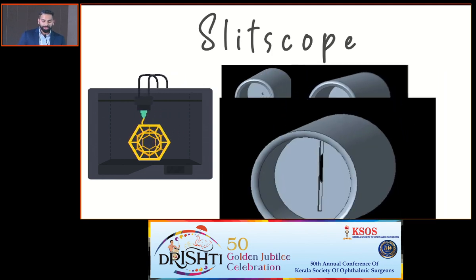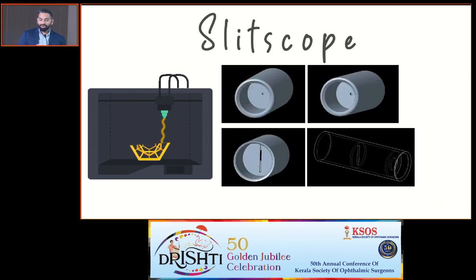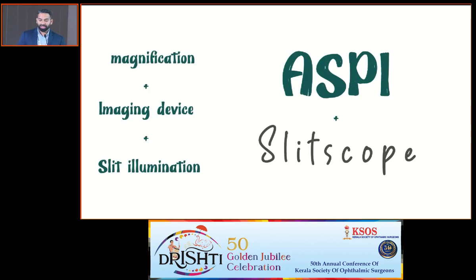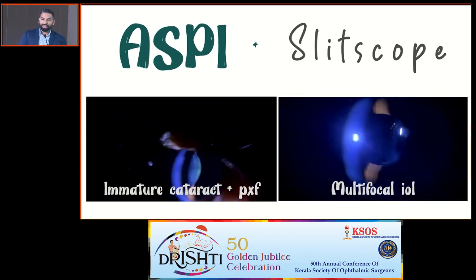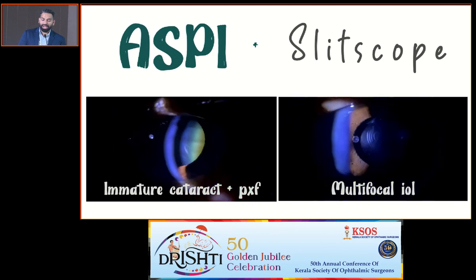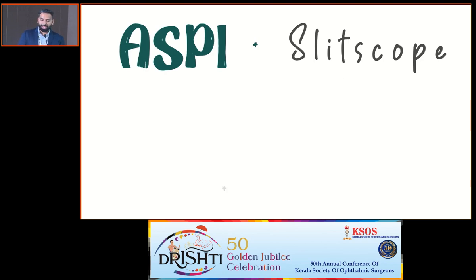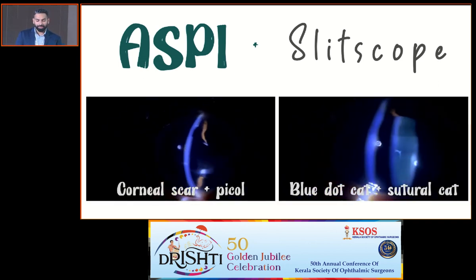So we took the technology to 3D printing and we started designing devices of different shapes and sizes, circle, square, all types, and it came up to 350 rupees, and we just added it to the torchlight. Along with ASPI and Slitscope together, we are able to take images equivalent to that of a slit lamp, and that also doesn't even cost you as much as a slit lamp, maybe a few thousand rupees.